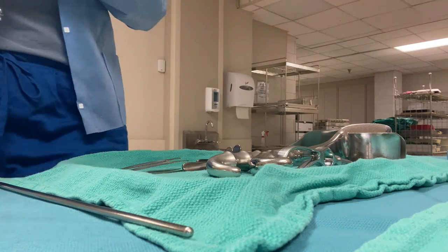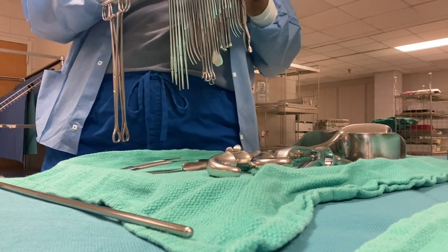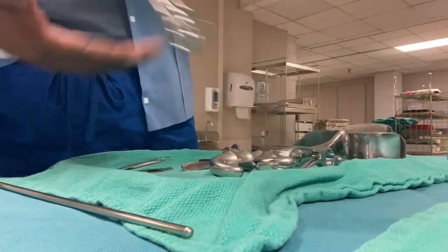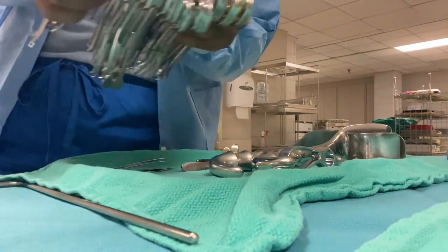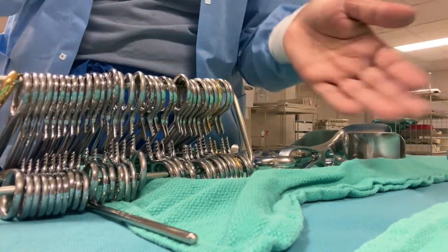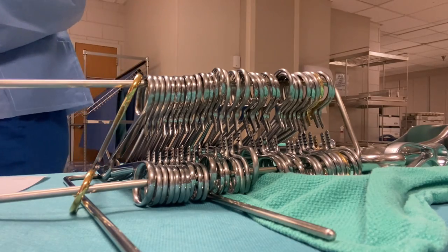Yeah, the worst thing, I hate when you're doing your stringer and you put it down in an awkward way and they all fall. And that means you gotta start all over. One, you gotta send your tray back to decon, because once instruments fall on the floor, they have to be rewashed. So yeah, safe way is to lay them down. And I'm just letting y'all know that they didn't fall on nothing, but I like mine so neat, especially on camera. But that's the safest way, especially doing what I'm doing, trying to record and all that good stuff.